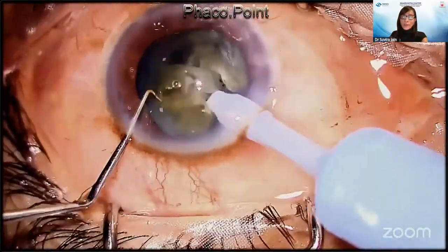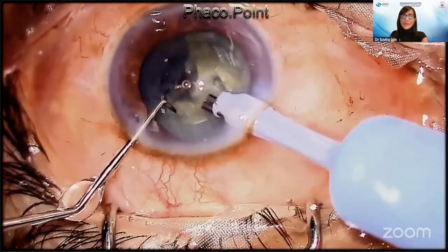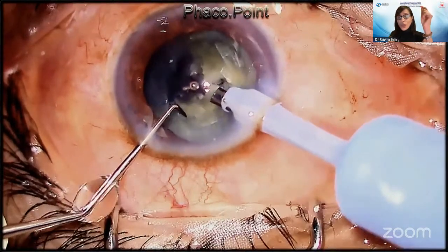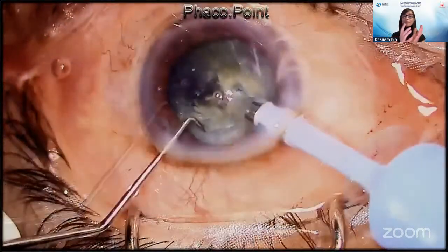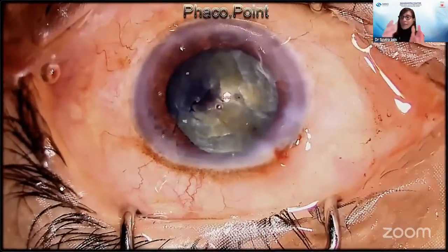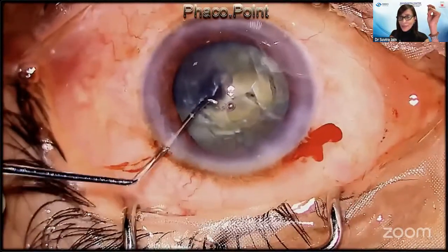The first fragment has come up effortlessly and has been emulsified. But notice the length of the chopper. At the time this fragment was brought up, probably the PC has given way, and you can see a splaying away of the fragments signifying the possibility of a rent.